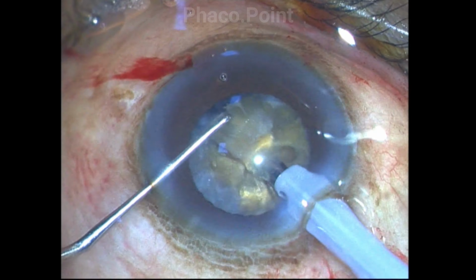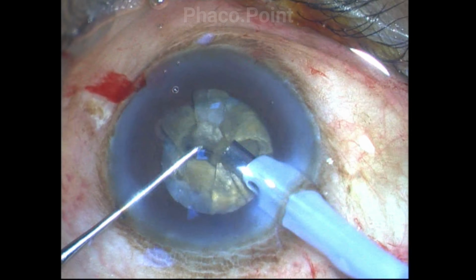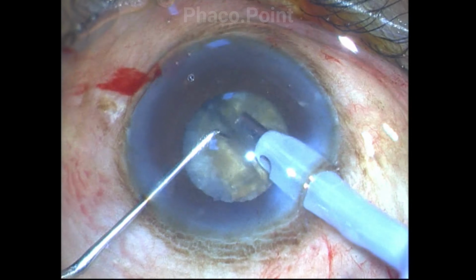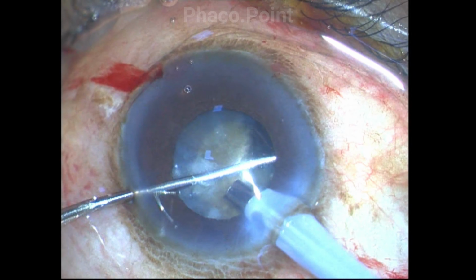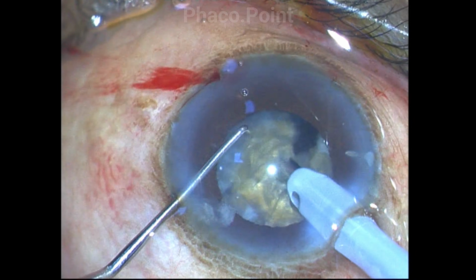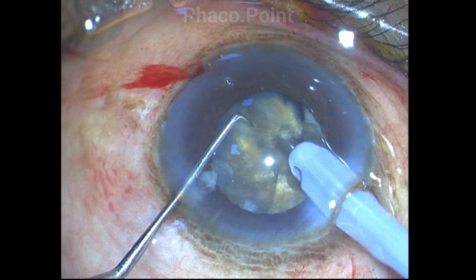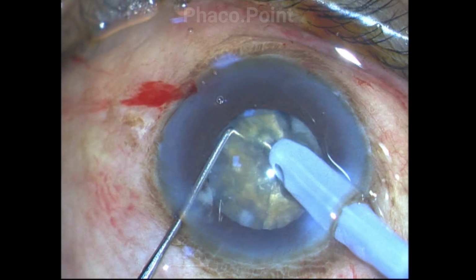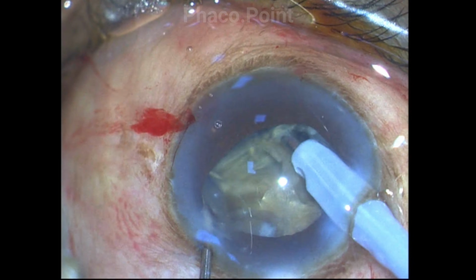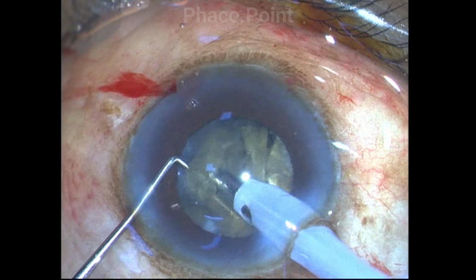In a sequential manner, the surgeon now brings one fragment up at a time in the phaco safe zone of the pupil, downsizes and emulsifies it. So once one fragment is emulsified, the surgeon rotates, and please watch how the fragments are brought up and emulsified. Now if they are a little large, like this particular one is, note how the surgeon buries into it, holds it in foot pedal 2, and before bringing it up, after maintaining a hold, breaks that fragment into two smaller fragments which are subsequently brought up turn by turn and emulsified.